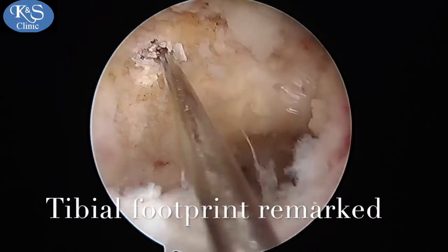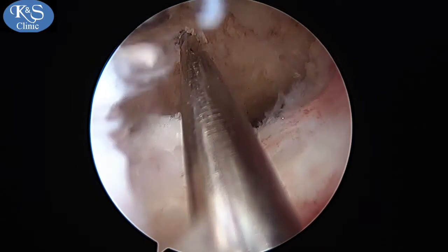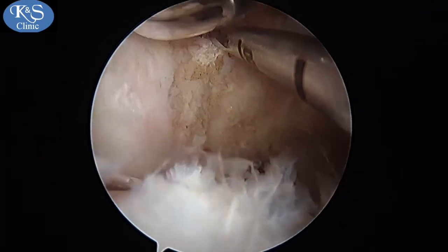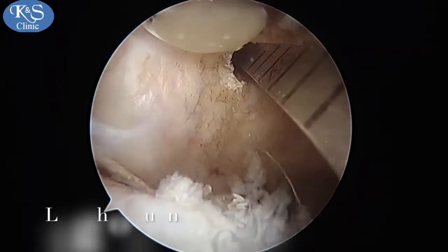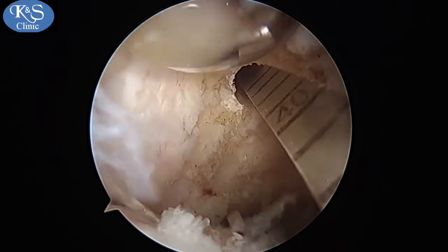The femoral footprint is then drilled. A high anterolateral portal is used to view the femoral footprint and drill with a low anterolateral portal, as this gives an end-on view of the femoral footprint of the PCL, so you know exactly where you are drilling.